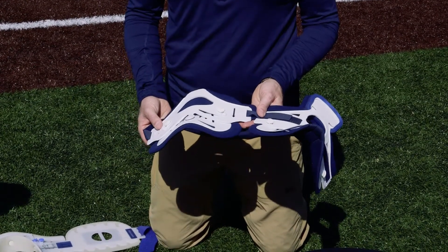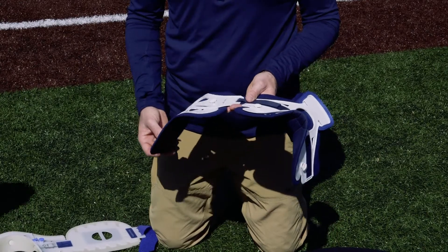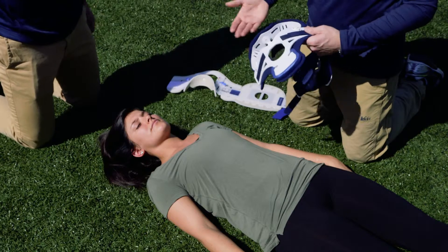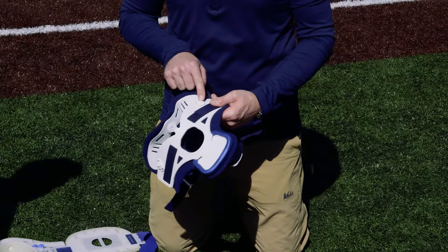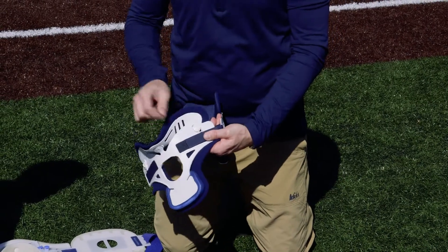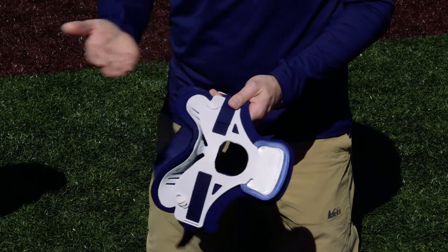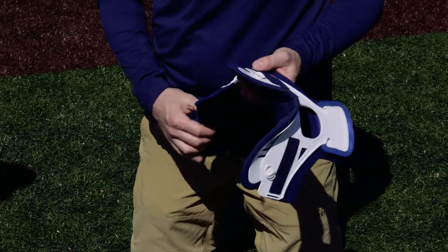One of the things we want to do is make sure the collar is sized correctly for the individual. Most C-collars are adjustable, though each one adjusts a little bit differently. This particular one has small little tabs that go up and down, which allows you to move it depending on their neck length.